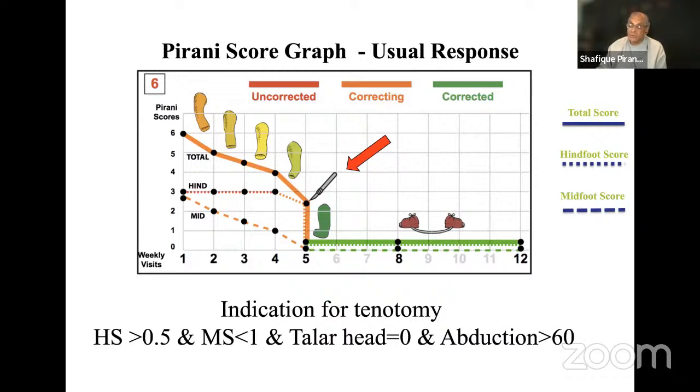And I've shown you the blade is inside the skin for just a few seconds. And the whole procedure, if you do it in the clinic, is very fast. It doesn't need the general anesthetic. In fact, I'd highly advise against general anesthetic because you're making the procedure much longer.